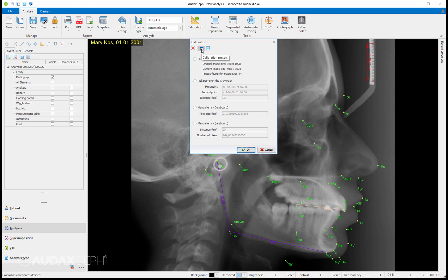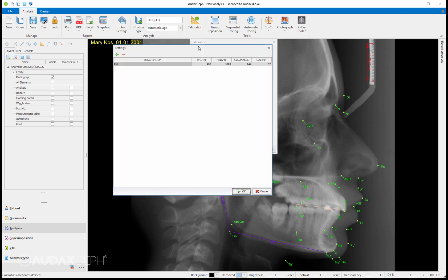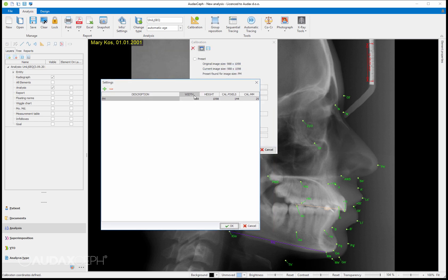If I check this calibration preset here, you can see that for a certain resolution of the image a certain number of pixels represents a certain distance. You can make this table bigger, for example for Instrumentarium, for Morita and so on, because a certain machine has a certain resolution and you can be pretty sure that you can define the machine based on the resolution.